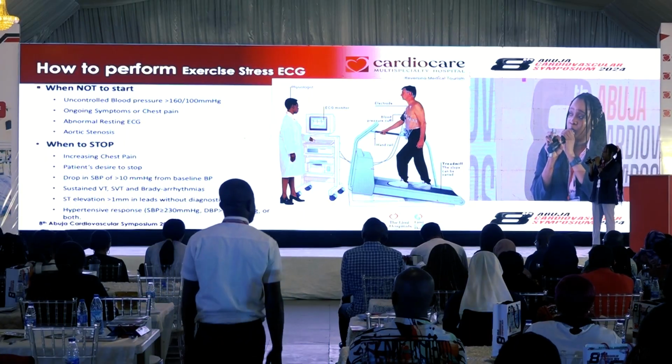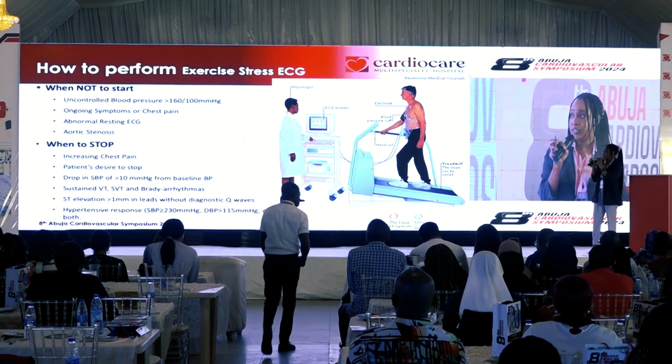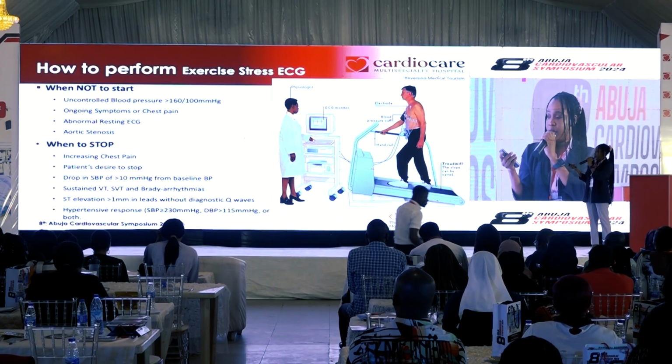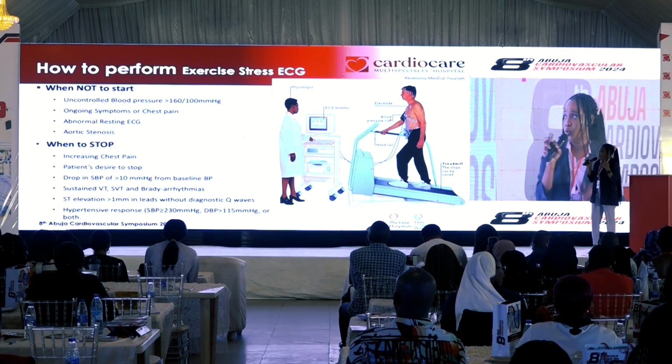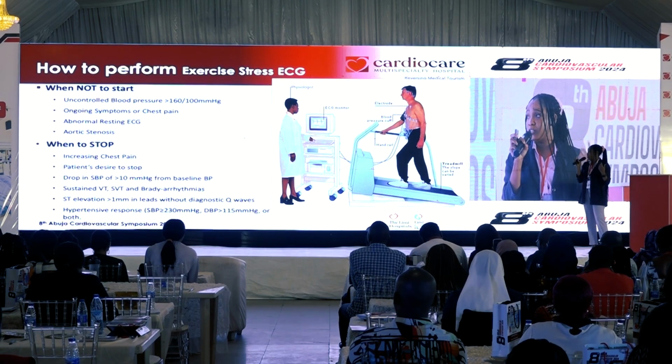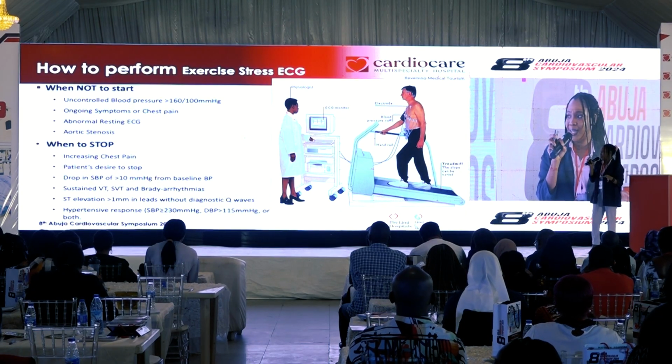So for ongoing symptoms and chest pain, if a guest is complaining of chest pain, we don't commence. Abnormal resting ECG and aortic stenosis, like I explained. So when to stop: increasing chest pain. So they're on the treadmill already, or they're using the pharmacological, and they're complaining, oh, I'm having chest pain. We terminate the test immediately.